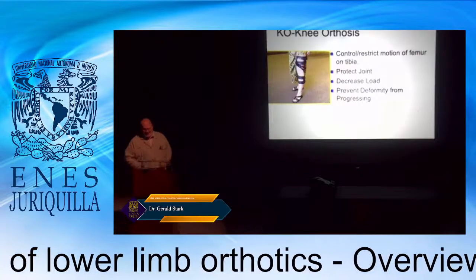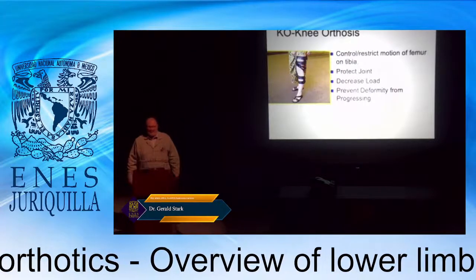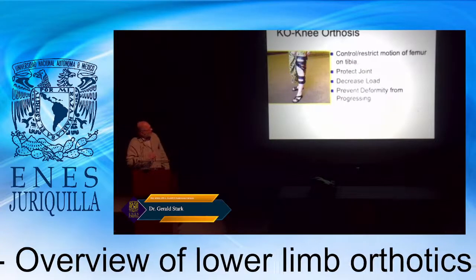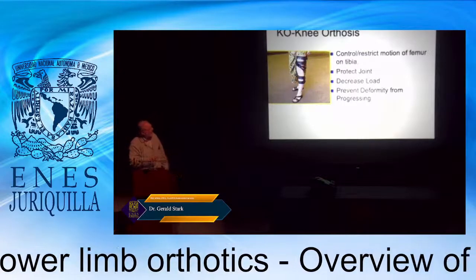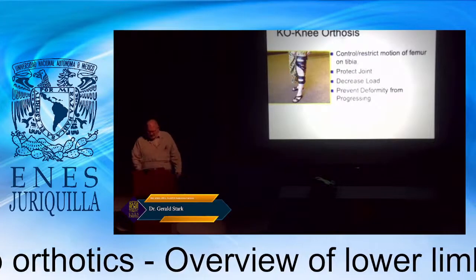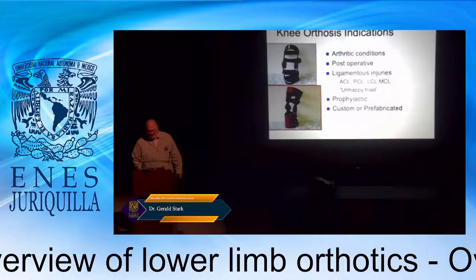And now we come to knee orthoses. How many of you have worn a knee orthosis for sports, right? Knee orthoses are becoming much more common now. If you can get a custom one, you get much more protection of your limb, and they're made with carbon and metal for that conformability, but also strength. So usually it's for arthritic conditions, but often due to sports injuries of your ligaments.